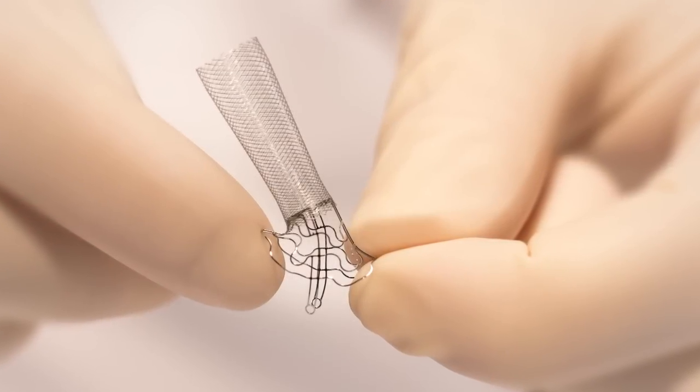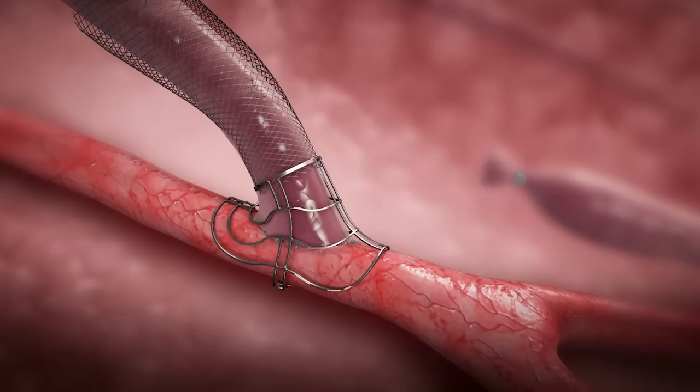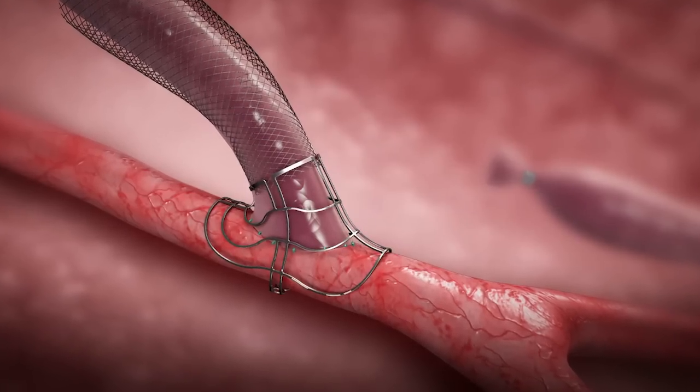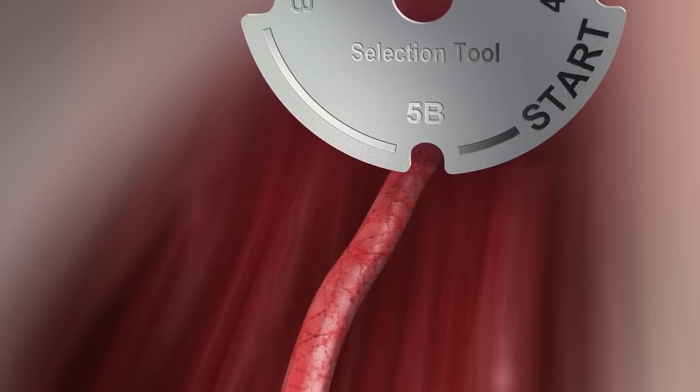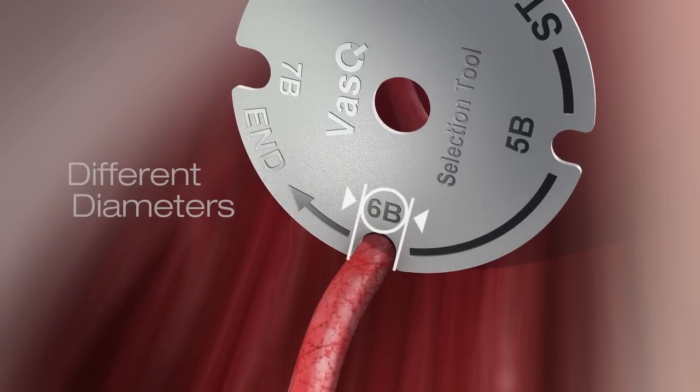The Vasq device is a nitinol braid surrounding the vein, welded to a nitinol brace hugging the artery near the junction site. The device is available in different diameters based on the artery diameter.